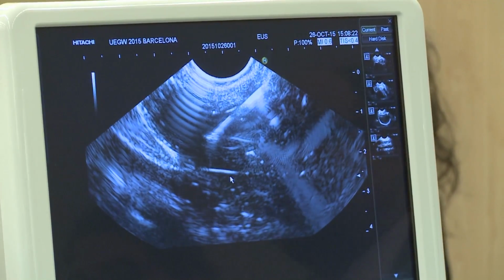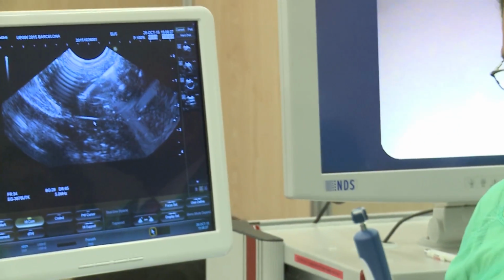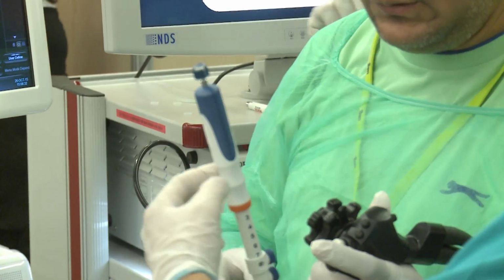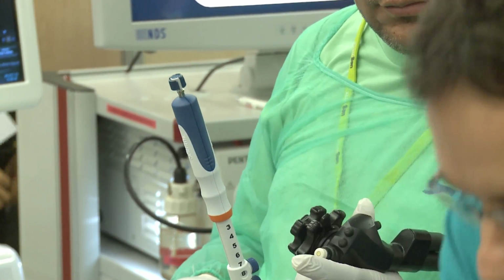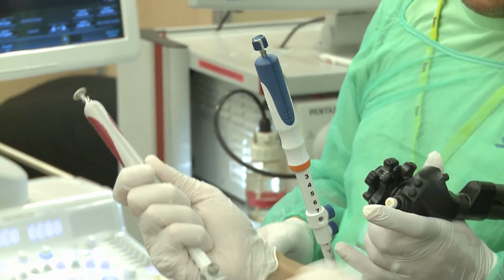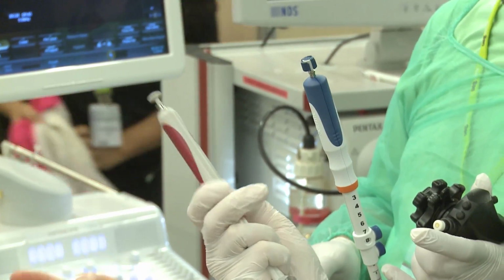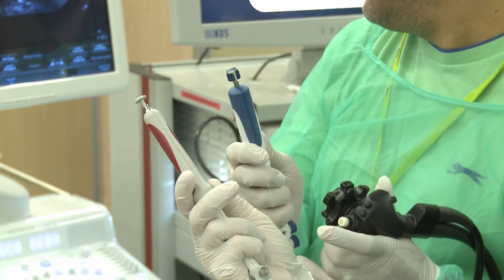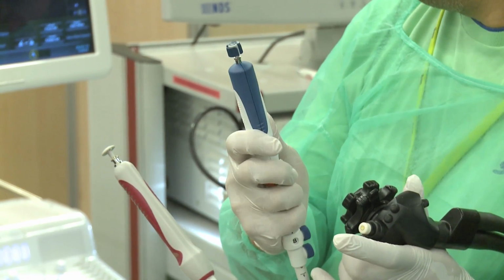Now, you just put it down to release, and then, what are the to and fro? The idea is not to use the hand in this position. Do you see how the handle is built? This is exactly the same as this. It is built so this is the position, so you use it like this. You hold it with a complete hand and you move it like that. Exactly. Finish? Easy.